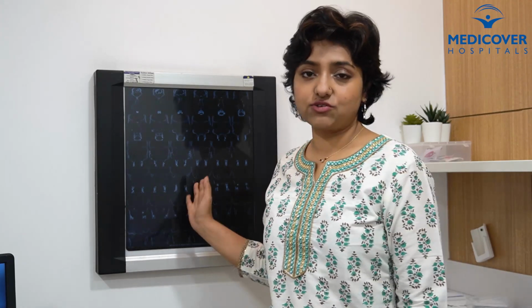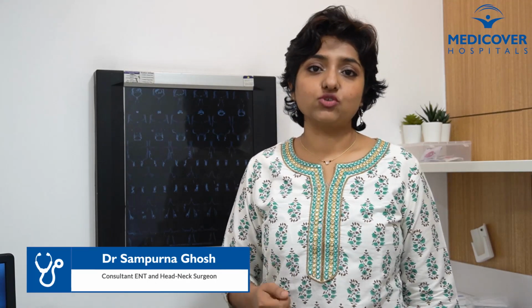Sometimes the person who has been believing for years that they suffer from chronic sinusitis actually turns out to have normal sinuses. The headache may be because of migraine. And sometimes the person who doesn't know that he or she has sinusitis can be diagnosed with sinusitis in the scan. So the scan is an important tool for an ENT surgeon to diagnose the disease and to make the treatment plan. Also, it helps us with navigation on the surgery table when I do endoscopic sinus surgery.